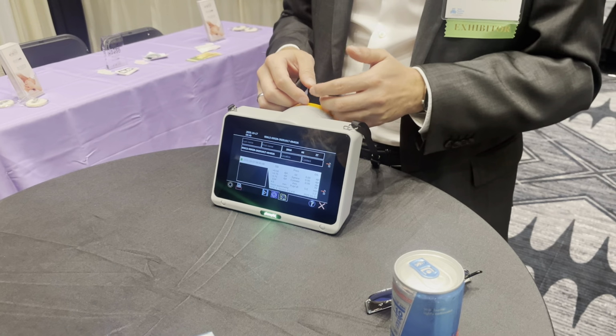Excellent. Red X brings us back to the start screen, and I may just want to show that to you because this is the red reflex test. I'm going to do that on you. You just look at that little smiley face. There we are. Oh, look at those beautiful eyes.